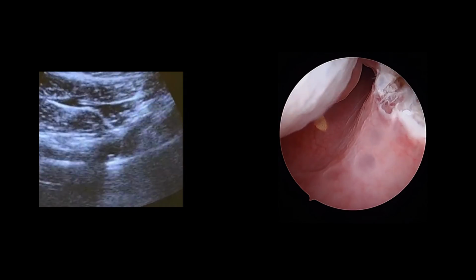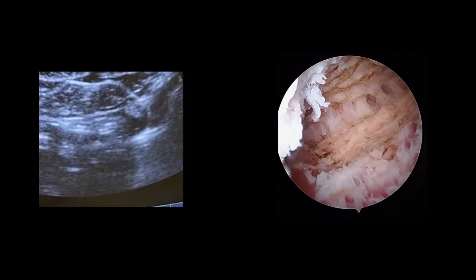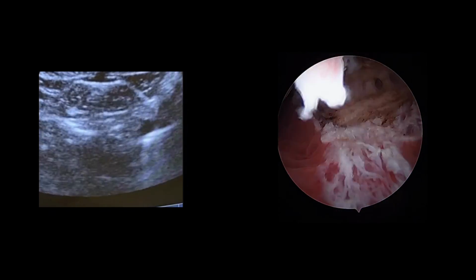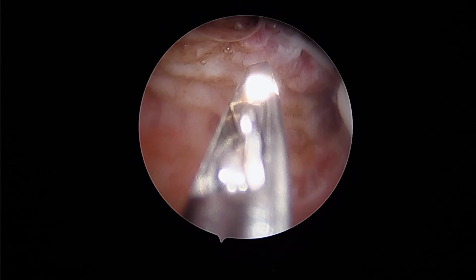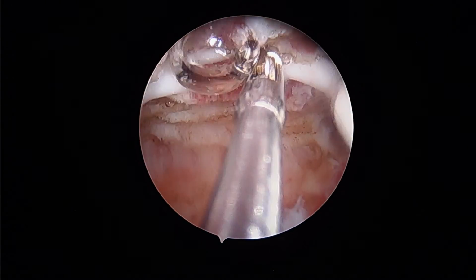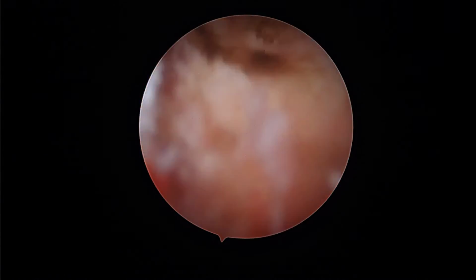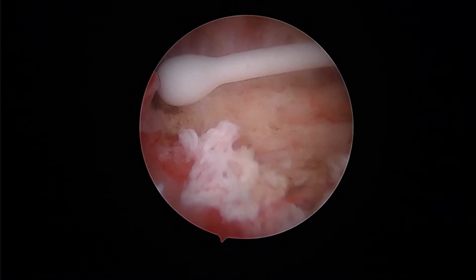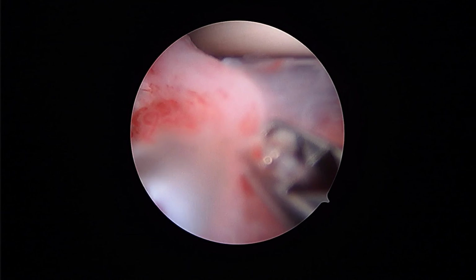Ultrasound was then used to confirm that the septum had been completely resected. As demonstrated, the filling defect that was seen previously was no longer present. The levonorgestrel-containing intrauterine system was inserted in the usual method. Placement was then confirmed using hysteroscopic visualization. The intrauterine device was noted to not be in optimal placement, so hysteroscopic graspers were utilized to reposition the device. Once the intrauterine device was in optimal position, the hysteroscope was removed and the procedure was complete.